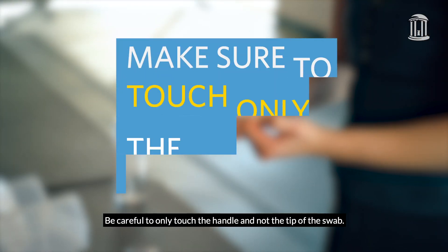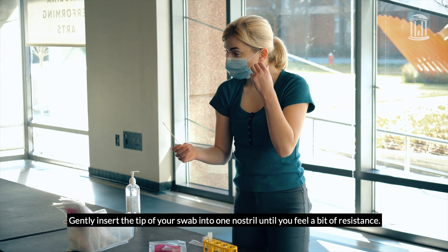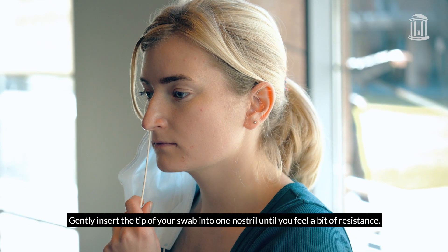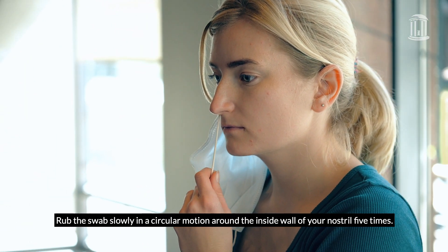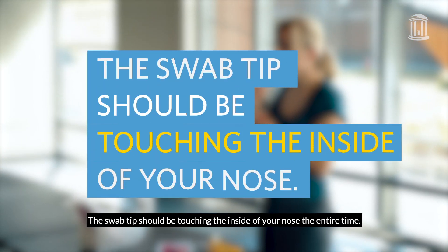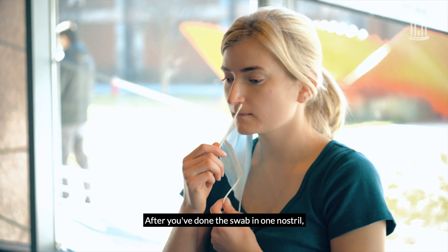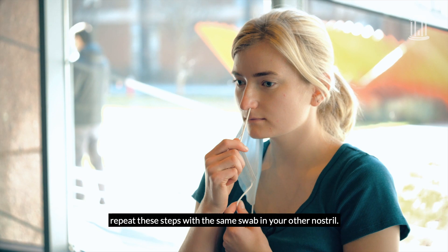Be careful to only touch the handle and not the tip of the swab. Gently insert the tip of your swab into one nostril until you feel a bit of resistance. Rub the swab slowly in a circular motion around the inside wall of your nostril five times. The swab tip should be touching the inside of your nose the entire time. After you've done the swab in one nostril, repeat these steps with the same swab in your other nostril.